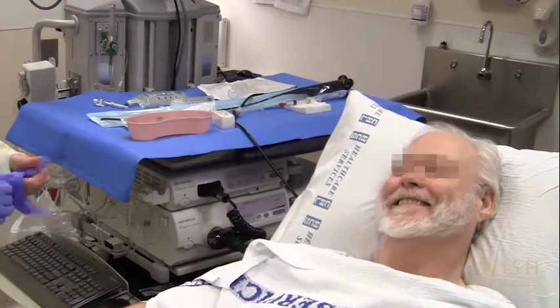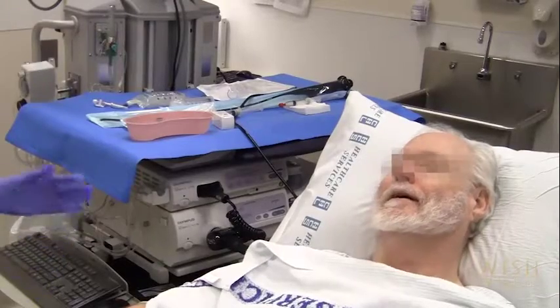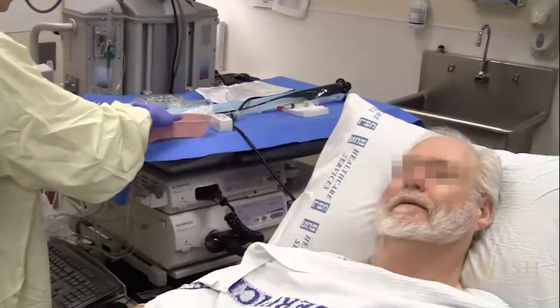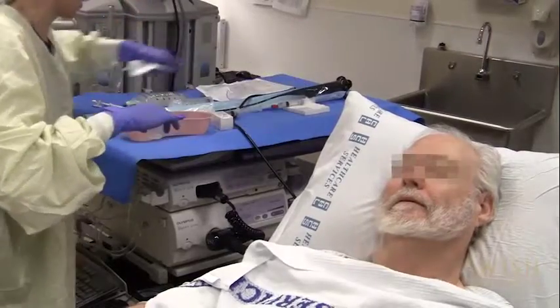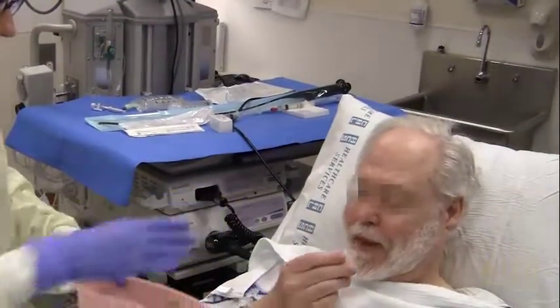Lidocaine is the main drug used for airway preparation. Its action as a local anesthetic numbs the airway and reduces cough. The choice of methods used for topical anesthesia is a matter of provider preference. We will demonstrate the techniques commonly employed in the UWMC bronchoscopy suite.